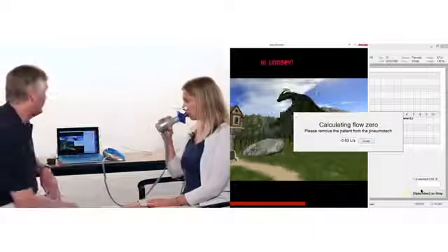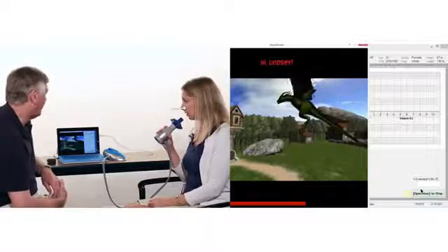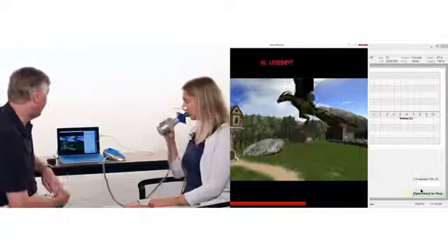You need to come off the mouthpiece there, Lindsay, just for a second. If they're breathing before the flow zero has been recorded, it alerted me. So on you go, thank you.